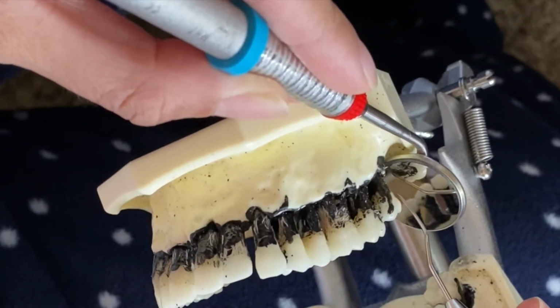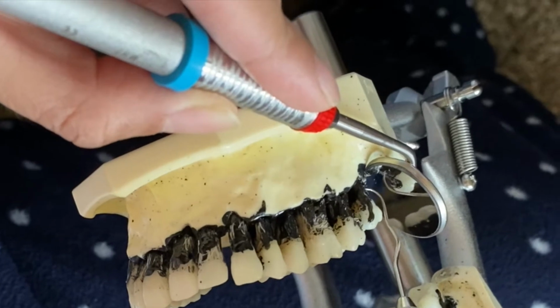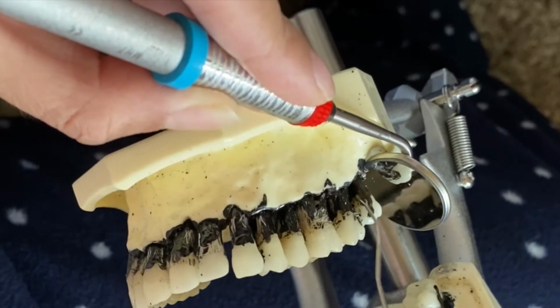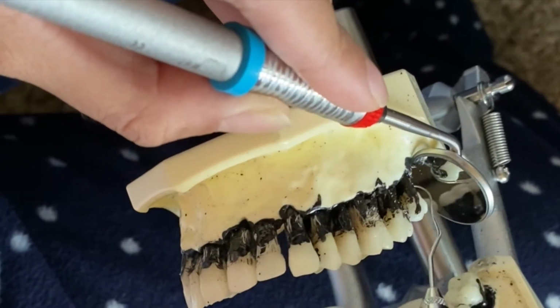Then I'm going to place my explorer at that distal line angle and go towards that distal surface. I'm going to take it out and reinsert at that distal line angle and go towards that mesial surface using different types of strokes. I was using the oblique stroke. I can go back and do vertical strokes. Then also going back with horizontal strokes.